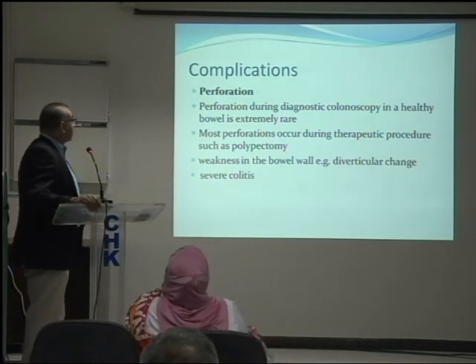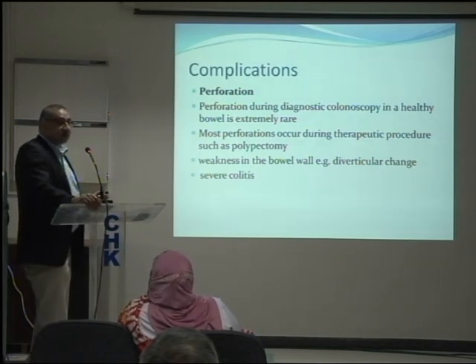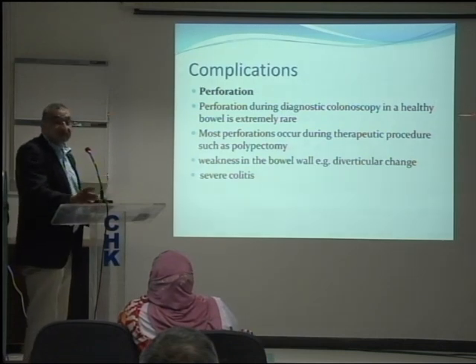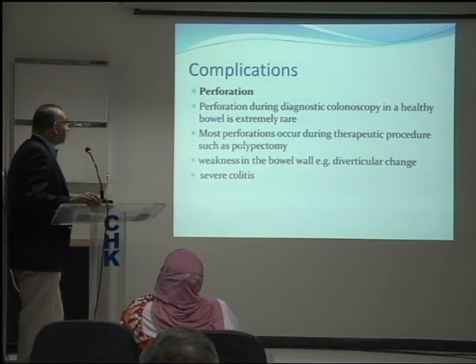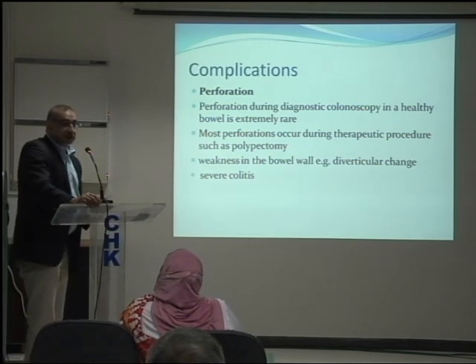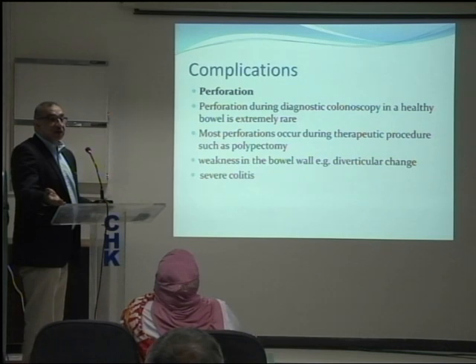Complications. The main complications that you get out of colonoscopy are perforation and what else? Bleeding, yeah? Okay. Perforation is one of the dreaded complications of colonoscopy. Now, obviously, when we talk about complications, we talk about the procedures as a whole, the numbers as a whole. But in a diagnostic procedure, it should never happen. I mean, why would you cause a complication if you are just having a look around?